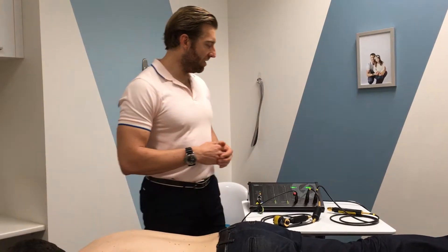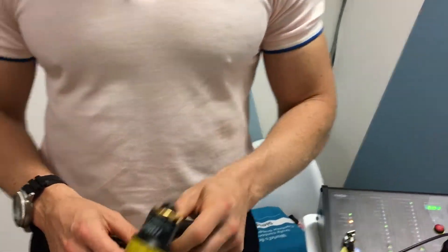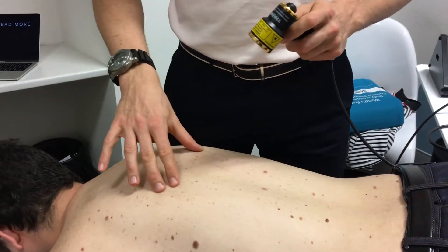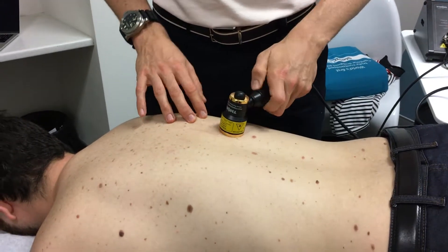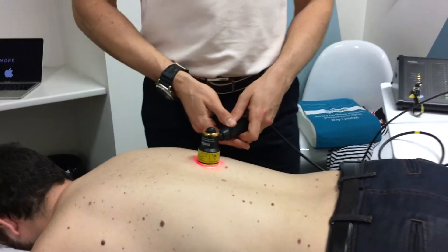I have the machine set up here and we're going to start by using this probe — this is an LED probe, light emitting diode. We simply palpate for any discomfort, trigger points, or simply the region where Lou has been complaining of. I'll place the probe up against his skin and we'll treat him for about 30 seconds.